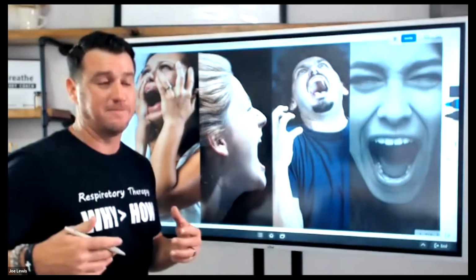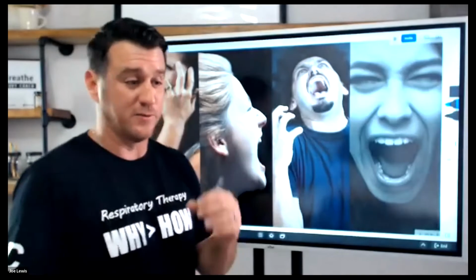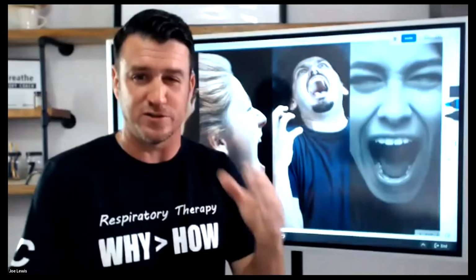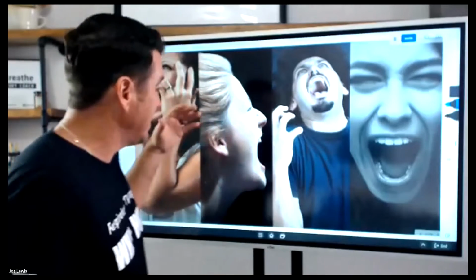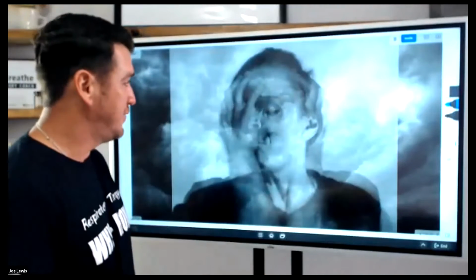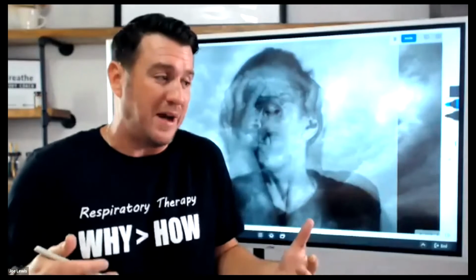And this is what, in my mind, I see when these patients are receiving mechanical ventilation and they're just fighting and they're so asynchronous. This is what I feel is happening in their head. I feel like if they could, this is exactly what they would do. And what do we do? What do we do, right? We say, let's give more sedation. And all it does is take it to this fogginess, still a state of confusion, and my neural drive may still not be satisfied.